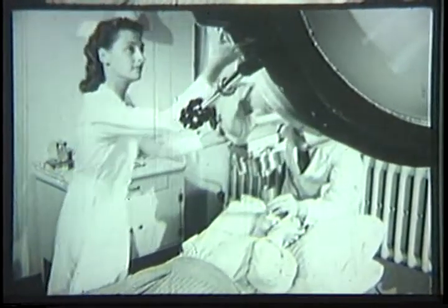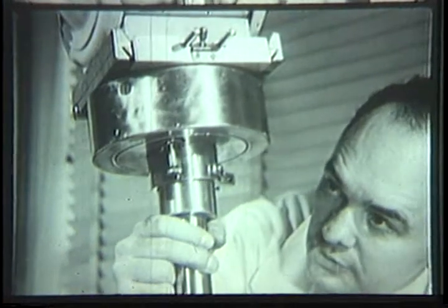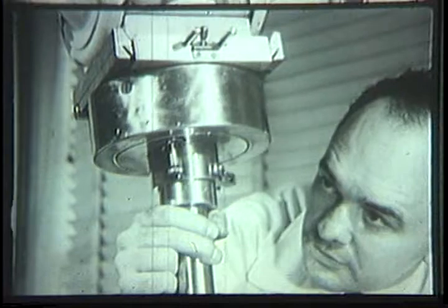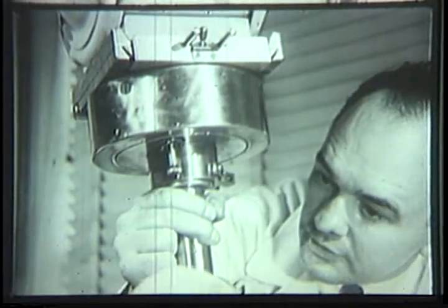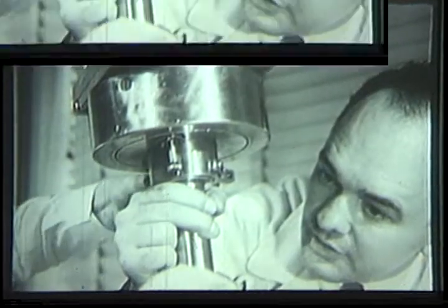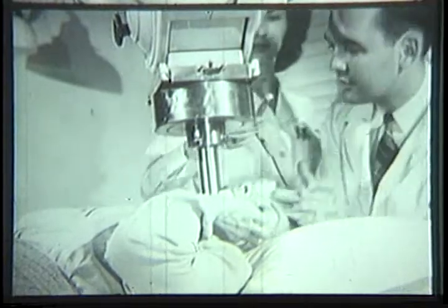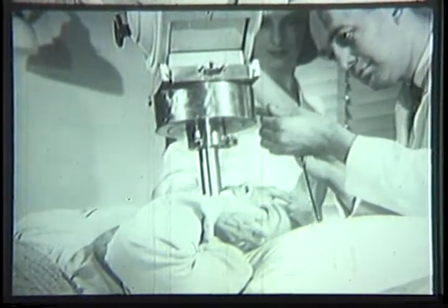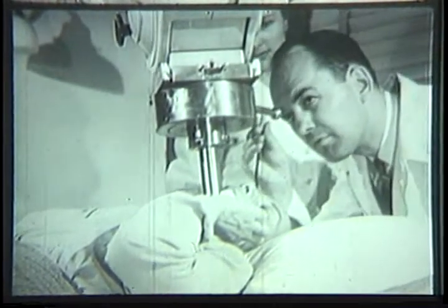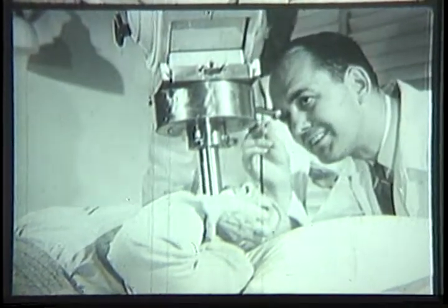The doctor holds the cone in place as the technician slowly and carefully raises the table until the cone can be connected to the X-ray machine. The position of the cone is accurately checked by using a periscope. With it, the doctor can see if the malignant area lies in the path of the X-rays directly under the cone.